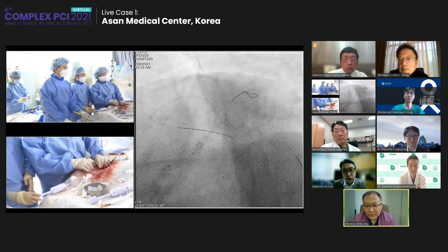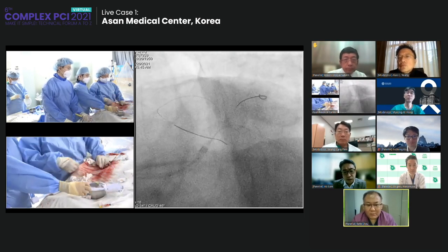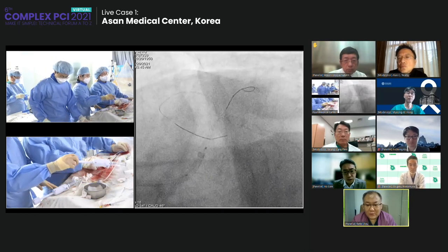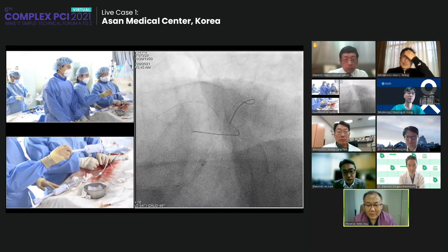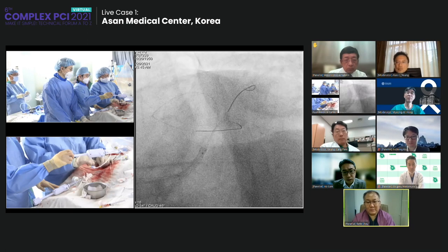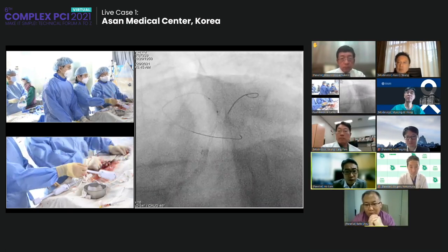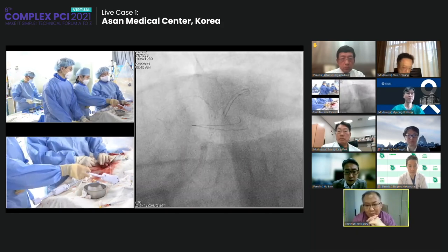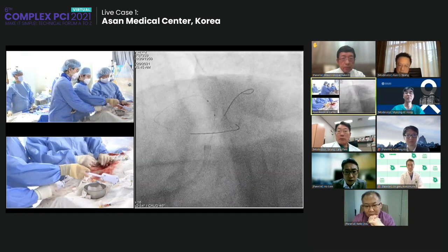I have some suggestion, Jimmy. Usually in this situation, I don't use a new non-compliant balloon because sometimes it's difficult to deliver it. I will just pull the stent balloon a little bit back and use high pressure. Then it could be the same result, I think. Okay, I agree with your opinion. You see, it's not easy to deliver the non-compliant balloon to the circumflex stent. Yes, I agree. I will try again.